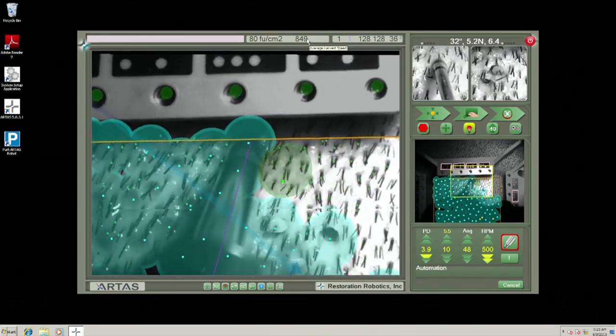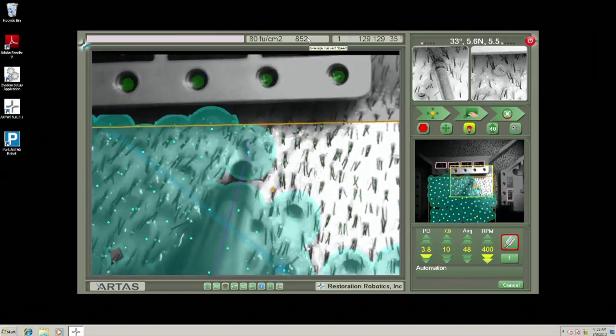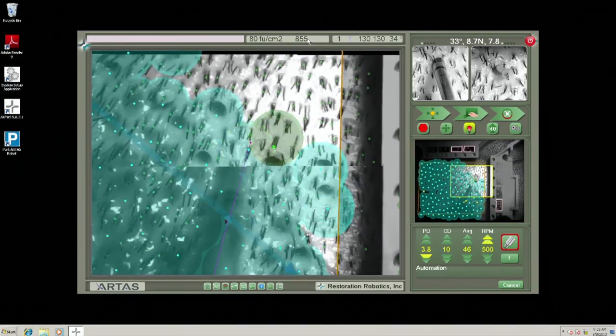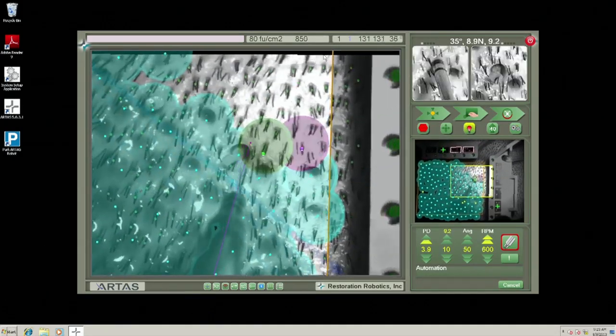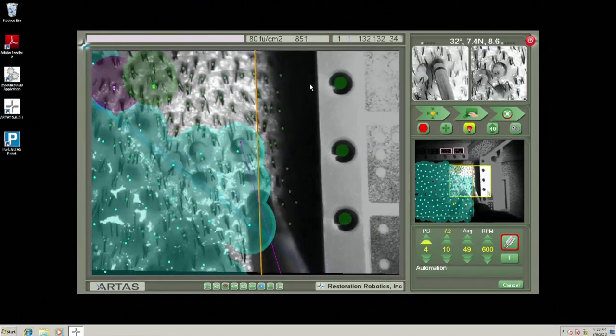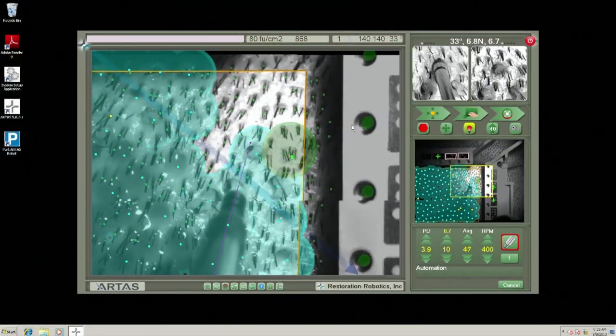Now we're up to almost 850 grafts per hour right now, so we're doing phenomenally fast. Our average harvest speed is probably around 1100. We're usually running even substantially faster than this, but there are different things that are patient specific that can help improve this, and other things that can actually slow this down for safety reasons. So in some cases where we might have a significant amount of dermatofibrosis, or where you're requiring a lot of force to get through the skin, then that will slow down our ability to dissect.